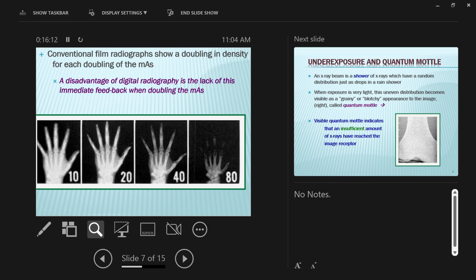Okay, yeah. I think there should be an in-between between the 20 and the 40. Sure, maybe like 35. They're both sort of optimum. Yeah, they're both still fuzzy. But at 20, the tips are too bright and then they're too dark. So none of these are ideal. All it's showing you is how it changes, right? If you wanted to find what's ideal, maybe somewhere between 20 and 40 you'd find that happy spot.